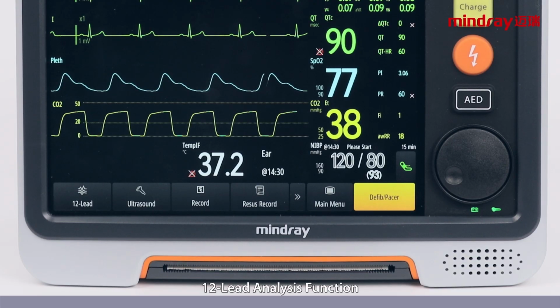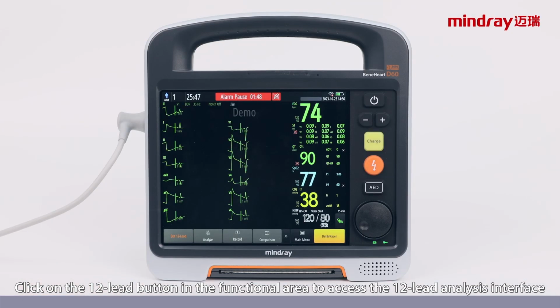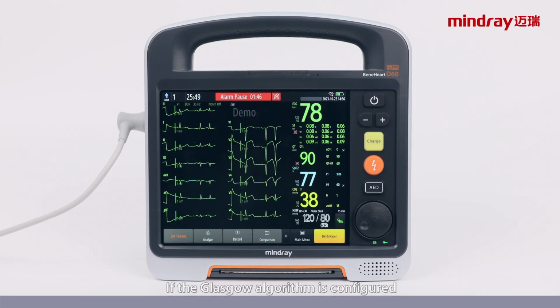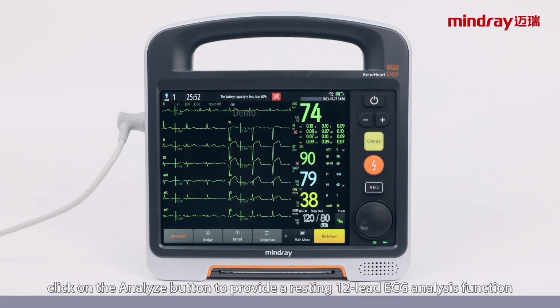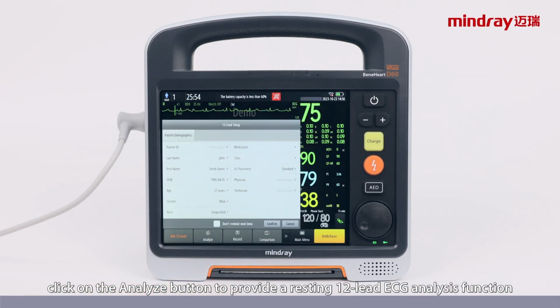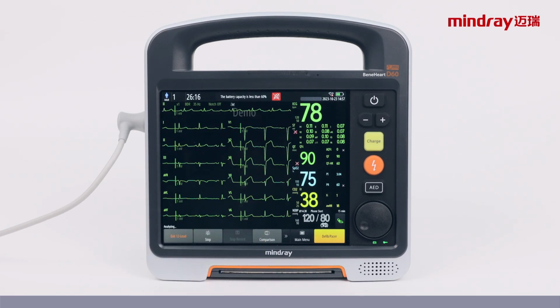Lead analysis function. Click on the 12 lead button in the functional area to access the 12 lead analysis interface. If the Glasgow algorithm is configured, click on the Analyze button to provide a resting 12 lead ECG analysis function. Press Confirm to accept the patient demographic information.